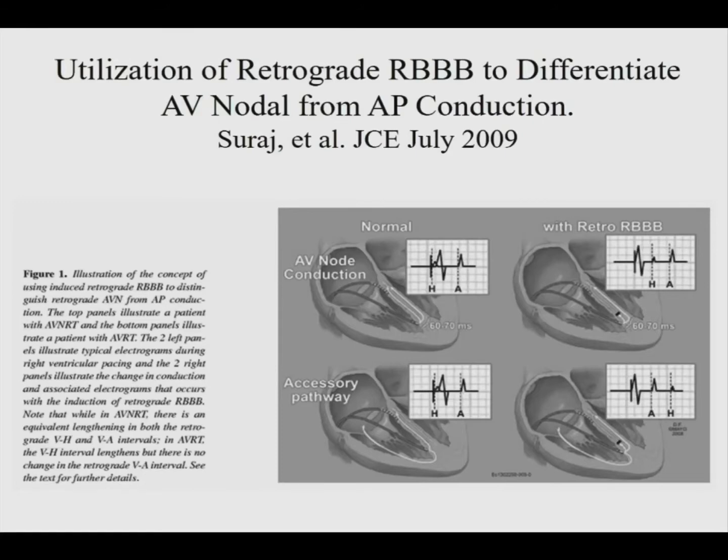All right, since you didn't see that slide. So the next step is you've induced tachycardia, and you want to know what type of tachycardia it is. So we're going to go through a list of tachycardia characteristics, but before I show you, I want you to just think about this. So what are the things that when you induce tachycardia you can look at?